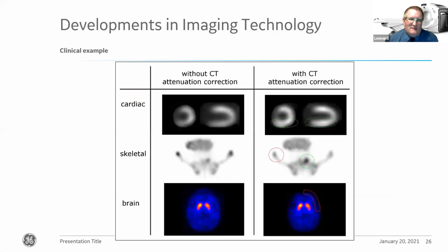As I say, it actually came initially from the cardiac imaging. So the top image here is actually of the heart, and we're looking at exactly what is going on. If there's areas where there's not much uptake, we could say that's due to a potential heart attack, or that some of the coronary arteries are being occluded, when in reality this could be a female patient and the breast tissue is stopping some of the photons from coming out at full energy, reducing their energy as they go. So that's a key thing to make sure it's accurate.